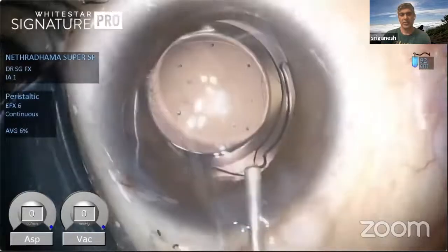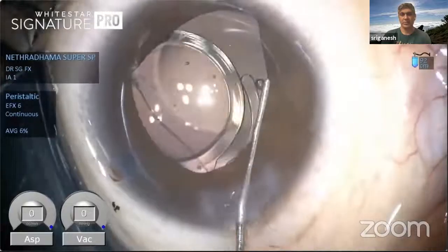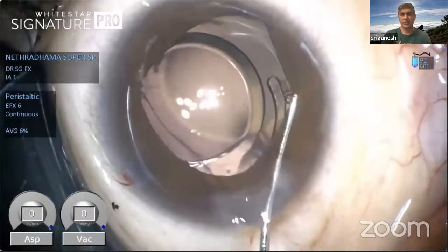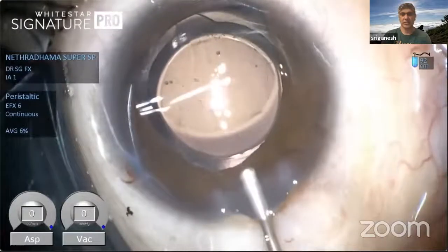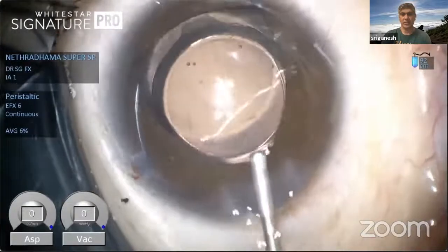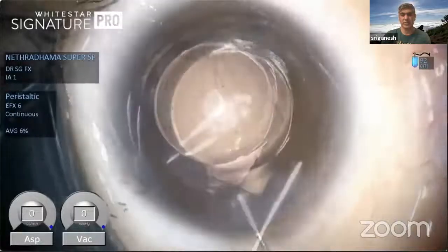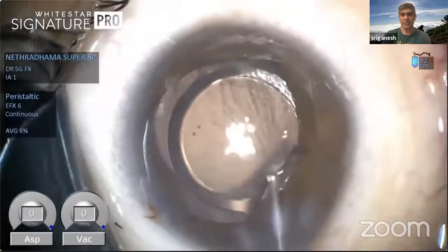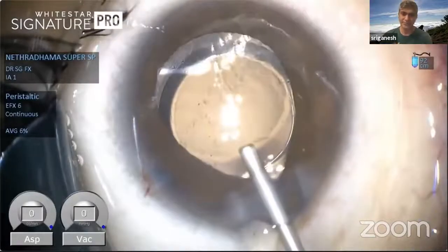Settle the IOL into the capsular bag, and after that you can just place back the haptics in the sulcus. That's the ICL again, which I'm placing back in under the iris in the sulcus. And this acts like a piggyback IOL. This patient had a very good correction.